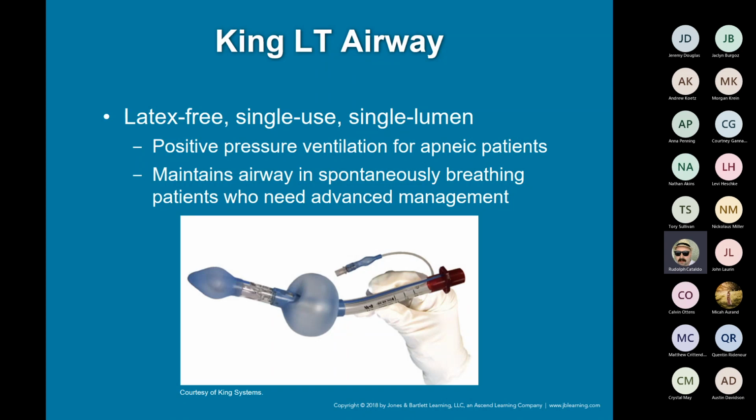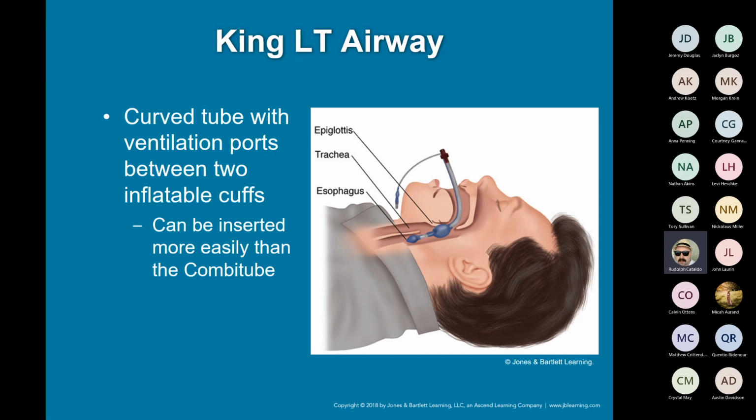The issue that some people see with them is they can kink really easily. I can't say I have had one kink, because an ET tube can technically kink too. They're all soft rubber, but I can see there potentially is that potential, depending on the position the airway is in of the patient. It looks very much like this when it's inserted.